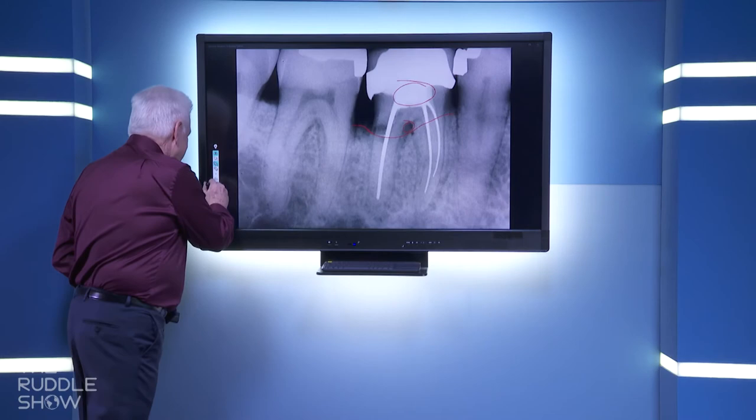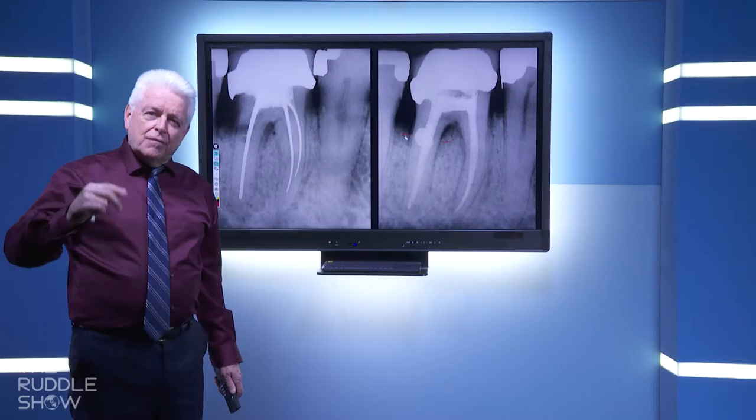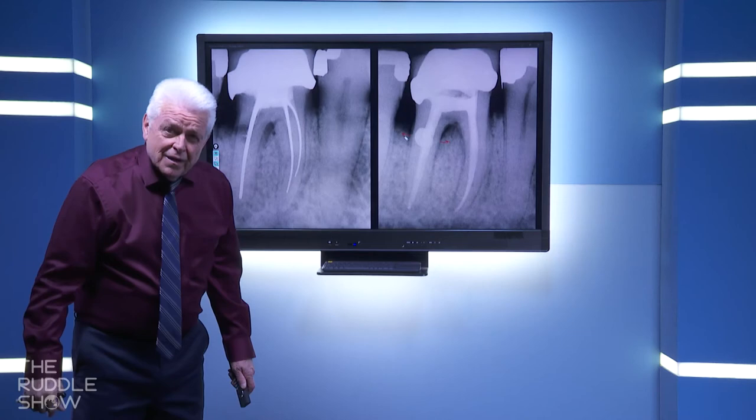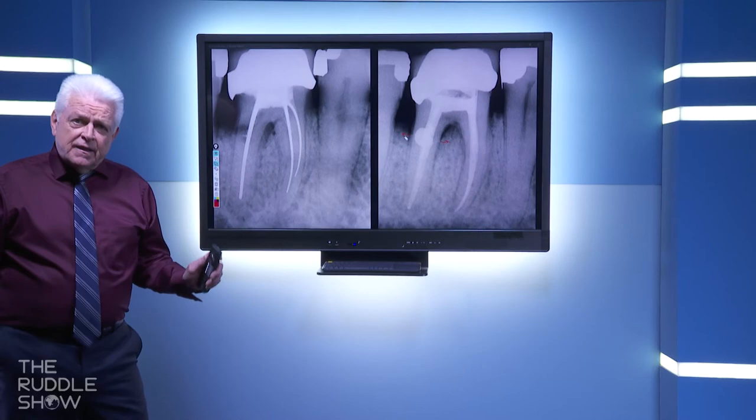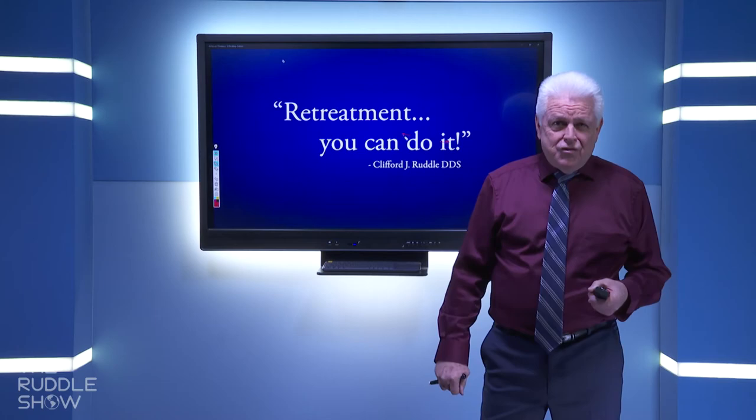So basically, we got them out, did a lot of irrigation. If you look very carefully, there is a little bit of communication out here. Larry passed away, so I never saw him again, but I was always wondering how the bone worked at the moment he did pass away, because it was about 2 years later. But he had the tooth, and that's a little lesson today on retreatment. We talked about silver points, and in that context, may you get your silver points out, may you have some ideas and some ways to think about doing it and have some fun.